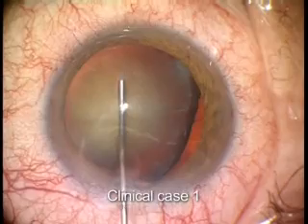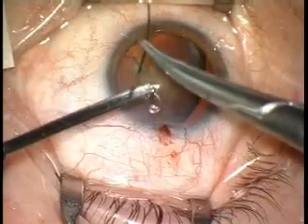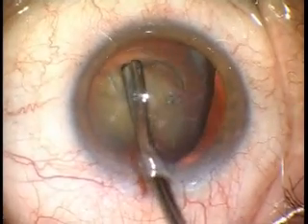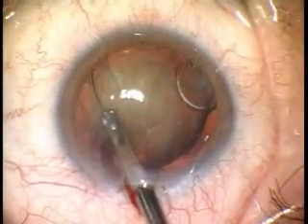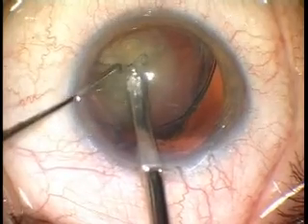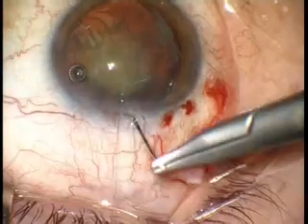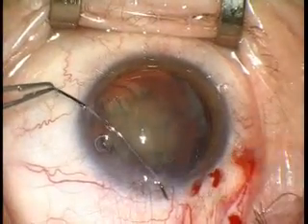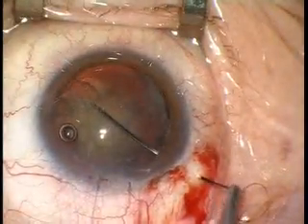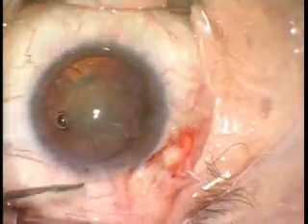In this patient, the zonular gap was diagnosed intraoperatively. The suture is secured to the ring eyelet. After anterior capsulorrhexis, the modified CTR is implanted into the bag. The ring reforms the circular contour of the capsular bag equator and the entire capsule is returned to the natural central position. The curved needle is guided into the corneal incision and passed into the ciliary sulcus using the ab interno technique. The device is then secured to the scleral wall with a Prolene suture in a zigzag fashion.